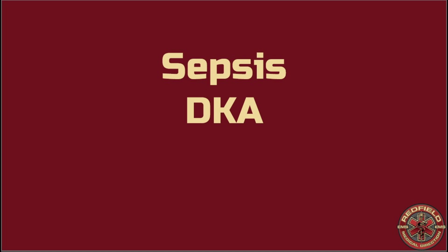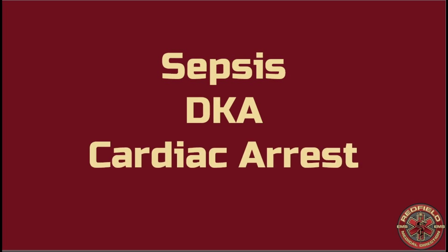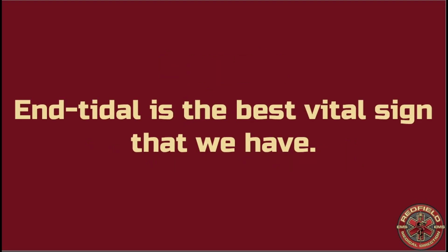And lastly, I think the big thing we also see in the cardiac arrest data is, are we getting good perfusion when we're doing CPR? Is it time to switch out? Did we just get ROSC? All these things matter. And in the grand scheme of things, end-tidal is probably our best vital sign that we have.